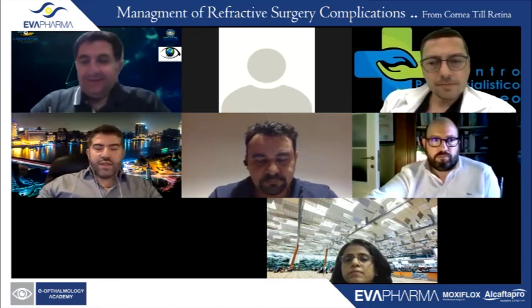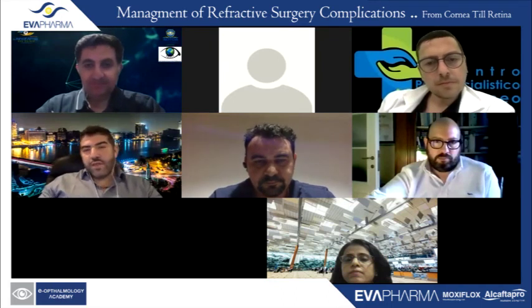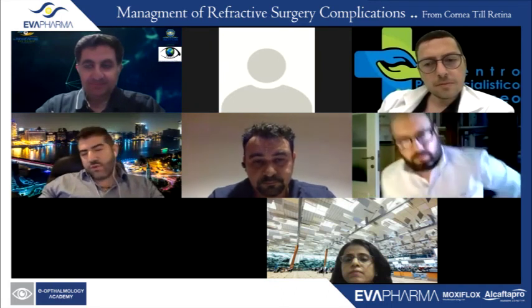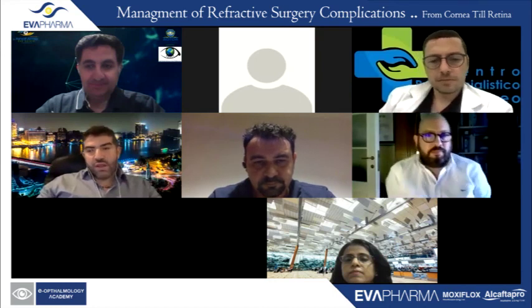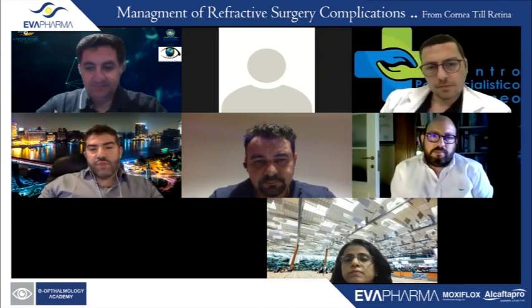Yes, I believe that the scar from the retinal cryopexy or the laser retinopexy is very strong. You can go for a suction ring, but I would recommend the femto laser in this case because the intraocular pressure doesn't rise that much.